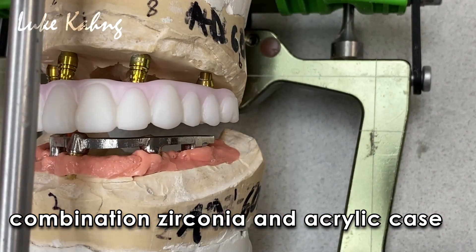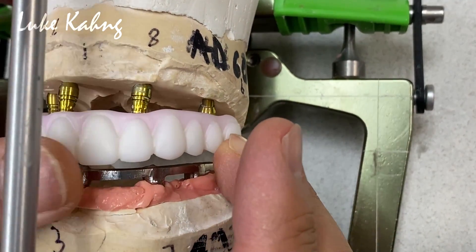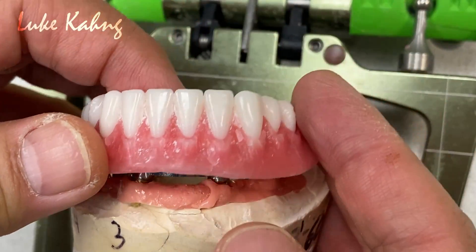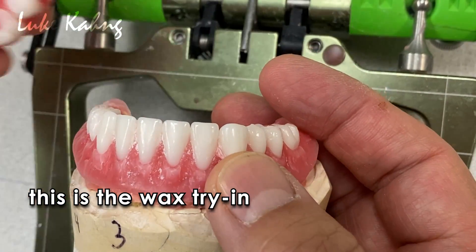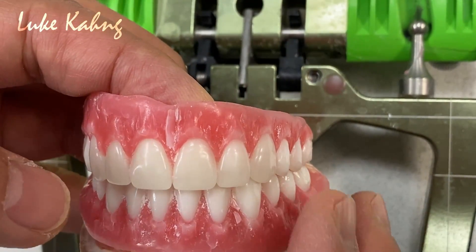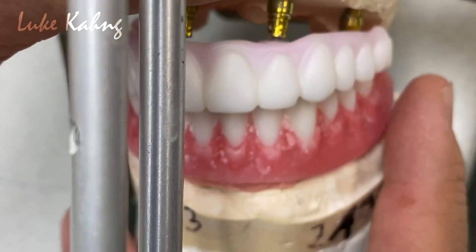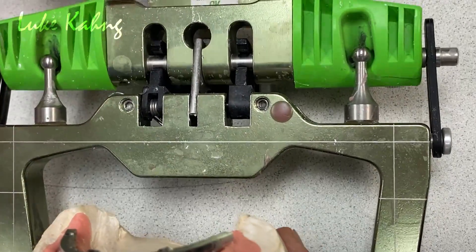This is the one-of-a-kind combination case. Upper is monolithic zirconia, and the lowers we made a hybrid bar with a design, scan and design, and mirror with titanium. This wax try-in is the basis. Then upper is as well with a wax try-in setup, and then we finished the monolithic upper, and then we can get the final framework for the future combination cases.